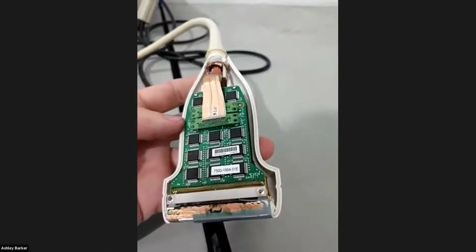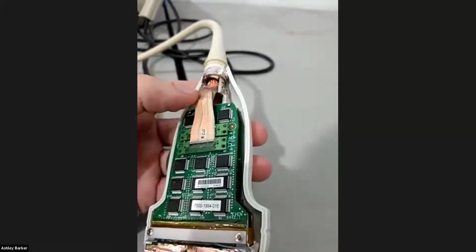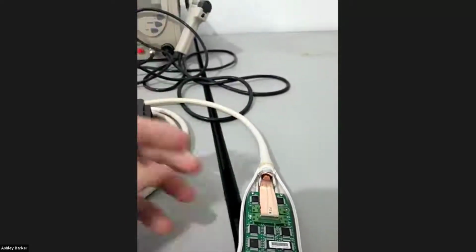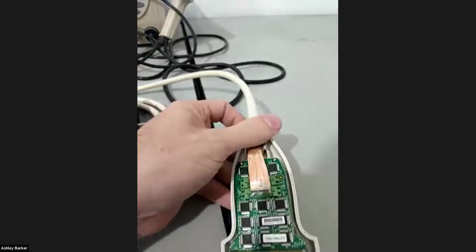Basically what it allows them to do is run many more elements in the end down fewer wires, so the wires are being shared between elements. Otherwise, on a probe that has so many elements in the end, you'd have this big giant cable that would be very annoying.